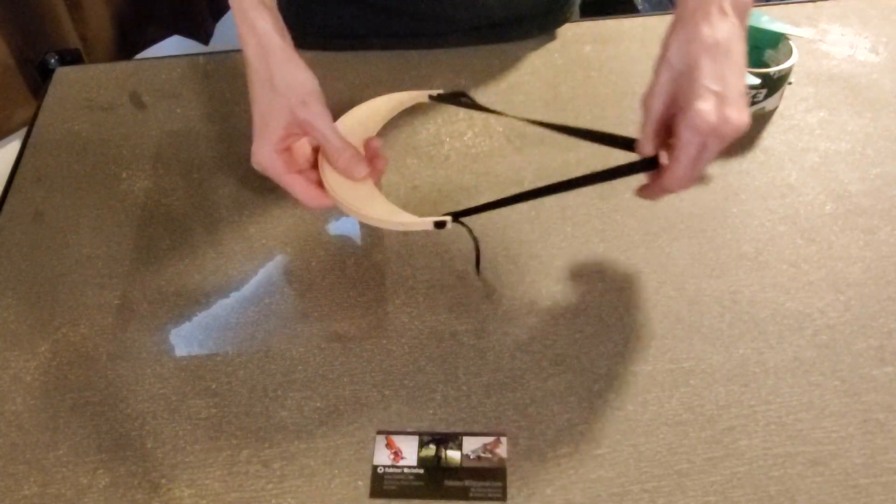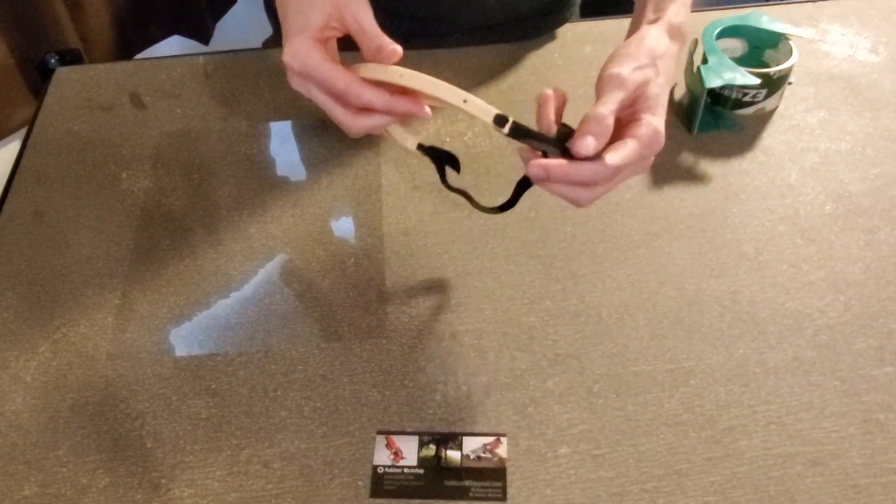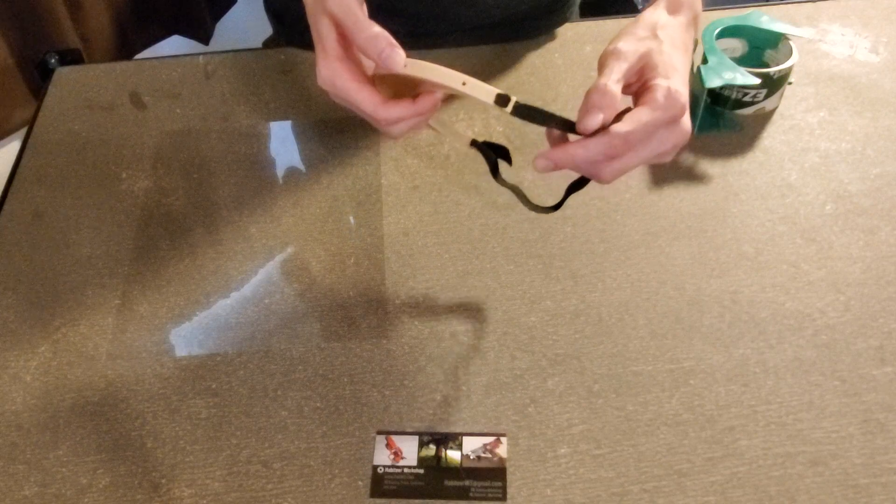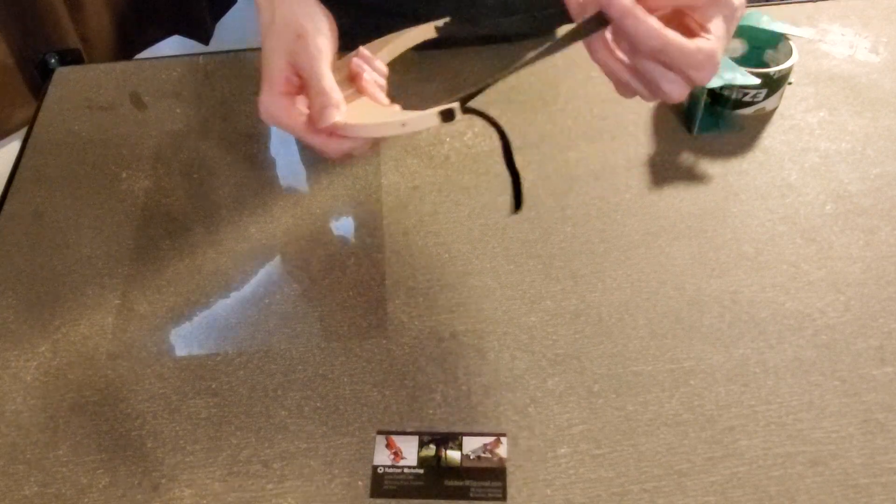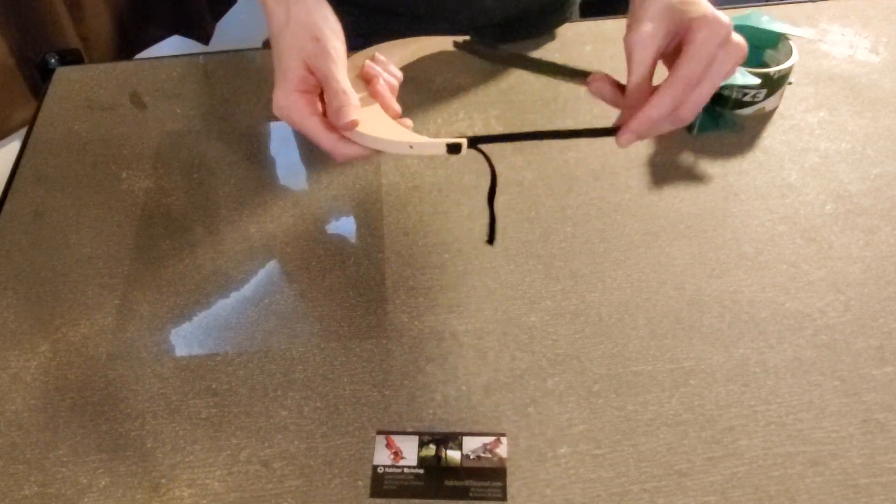So now it's all threaded in. This will make it so it's adjustable for anyone who wears it.